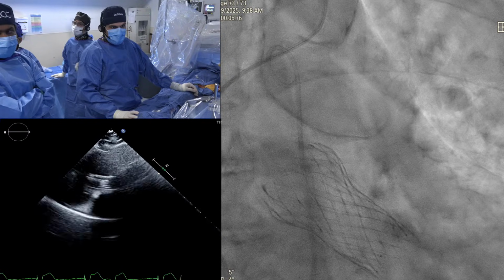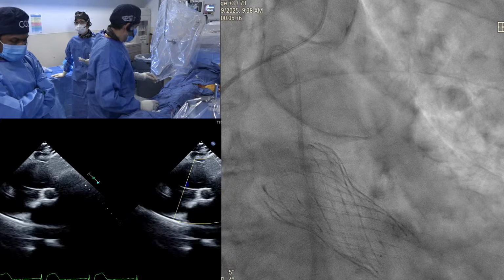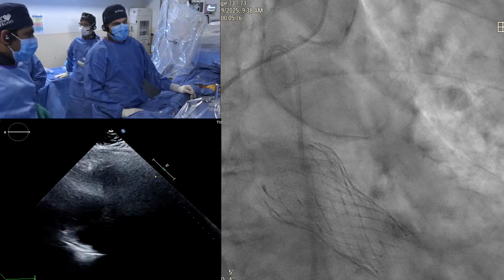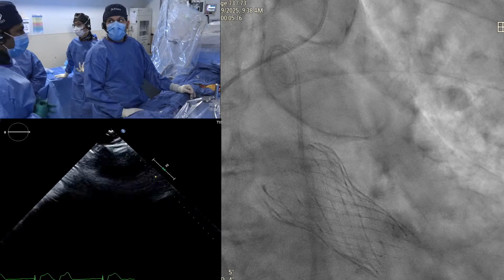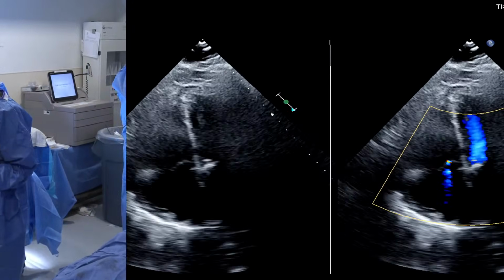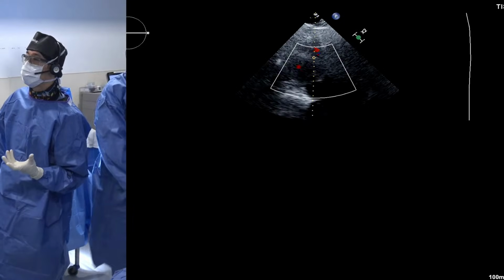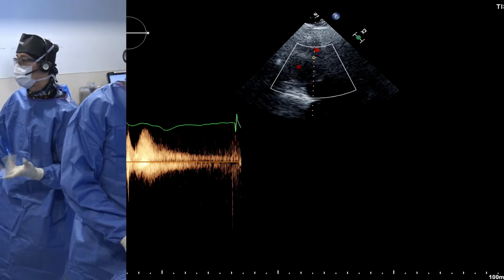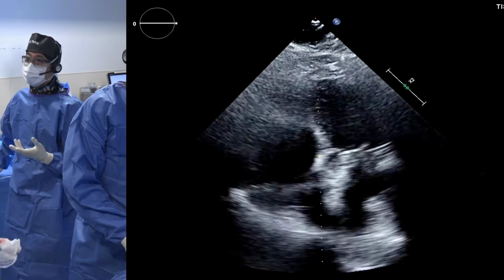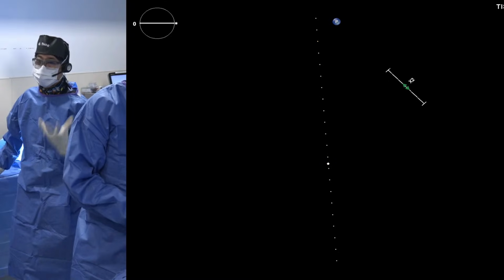However, we've been using certain balloon-expandable and self-expanding valves, depending on the particular anatomy. Reasonable results, actually. For balloon-expandable valves, we like them because of the radial strength, but don't oversize too much. If you oversize too much, you might risk aortic root injury. With self-expanding valves, you have to watch the LVOT. Typically these patients have a dilated LV and a big outflow tract. So if you use a self-expanding valve, you run the risk of ventricular movement on release. It's not as predictable, and there's been literature on that. Be prepared that if you use a self-expanding valve, you might need a balloon-expandable valve to rescue it if the self-expanding valve goes deep on release.